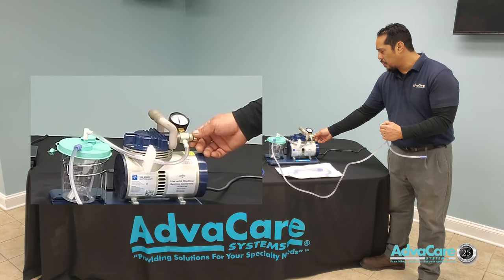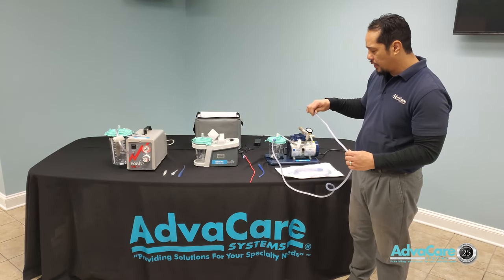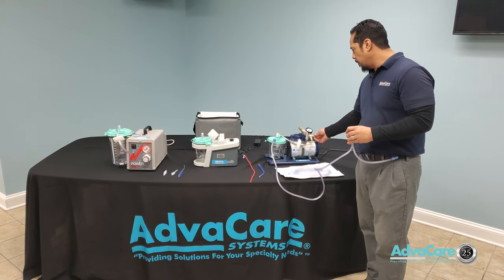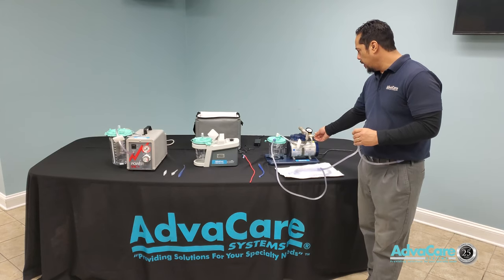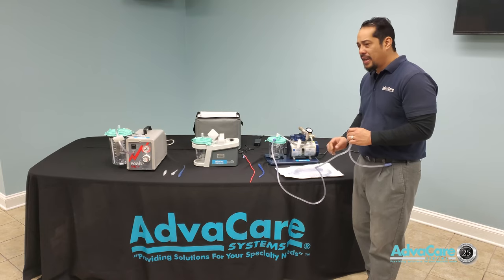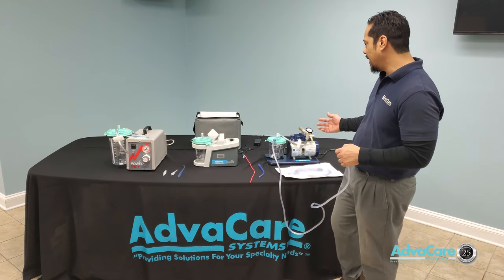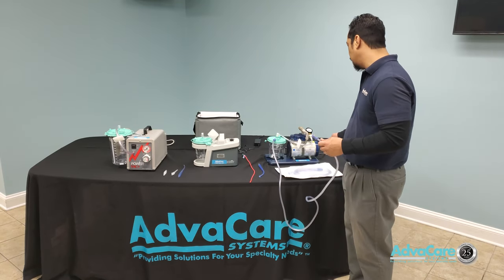It is always better to start somewhere in the middle of the available pressure so you do not cause any more disruption to the patient than needed. Whenever dialing in your pressure setting, always start halfway. If it is not strong enough, increase from there until the desired pressure is dialed in, and then you can adequately clear any type of fluid blockage.